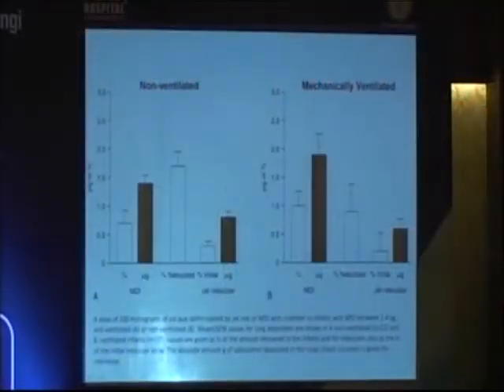They compared what the lung dose was in children with bronchopulmonary dysplasia. And what they found overall, this is looking at the lung dose, and on this axis it shows micrograms that are being delivered to the lung, or a percentage of the nominal dose that was being provided.